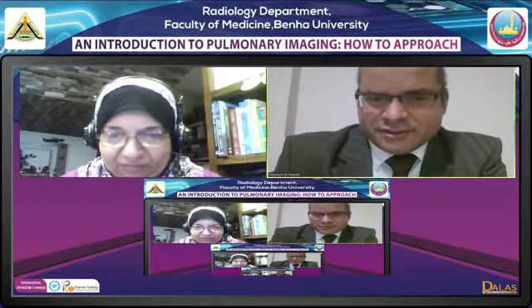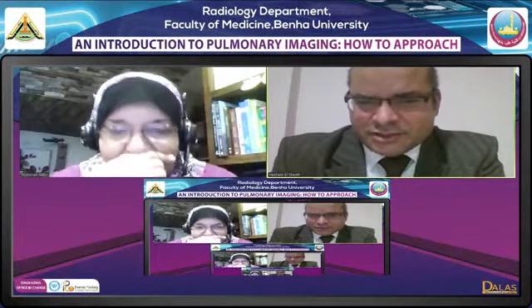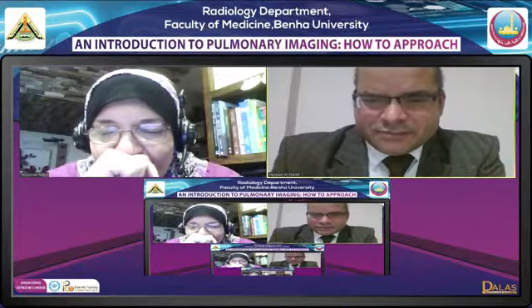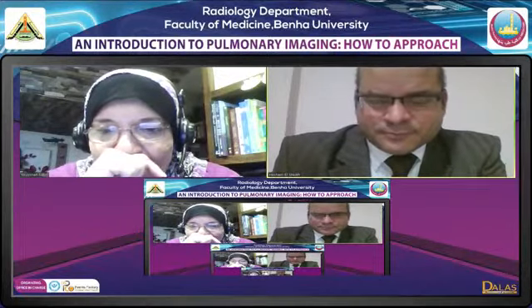And now I have 3 questions. The first one: how to differentiate cicatricial fibrosis and cavitary collapse and honeycombing.